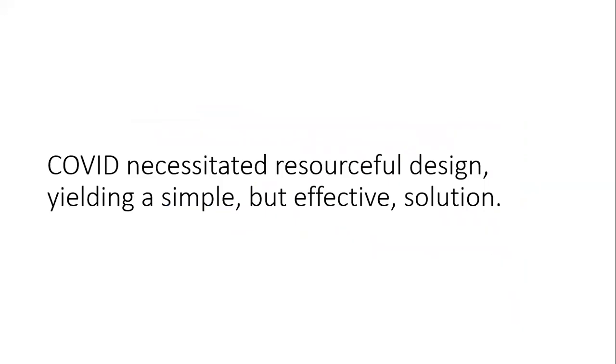One of the most profound reflections that I'd had from this experiment is that COVID necessitated that we come up with a resourceful design, which ended up yielding a simple but, as we could see, pretty effective solution. The Velcro loop is cheap, easy to manufacture, easy to distribute, easy to use, reusable, and it was effective under the conditions tested.